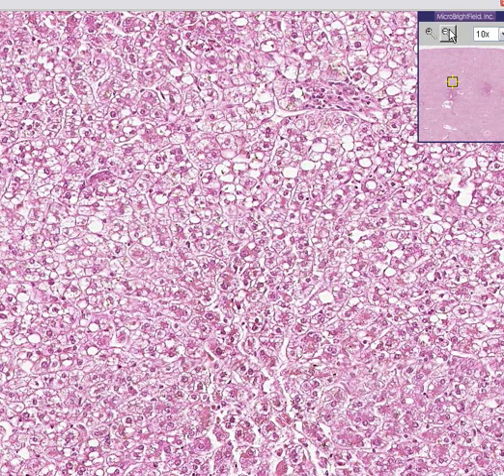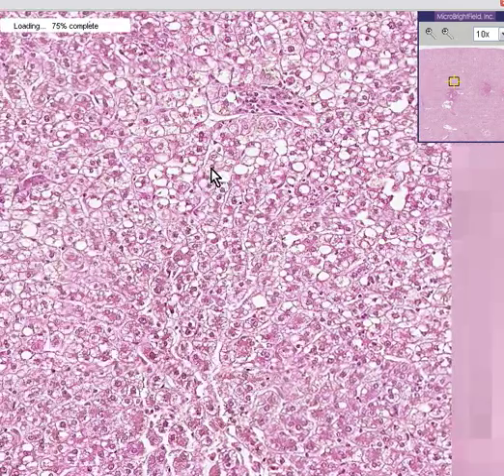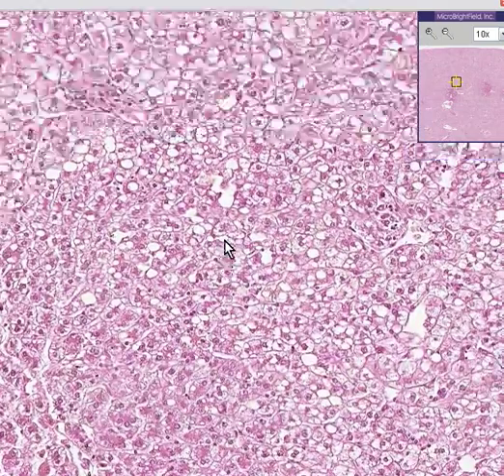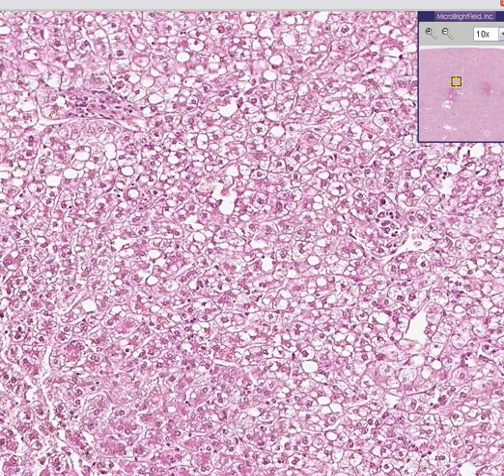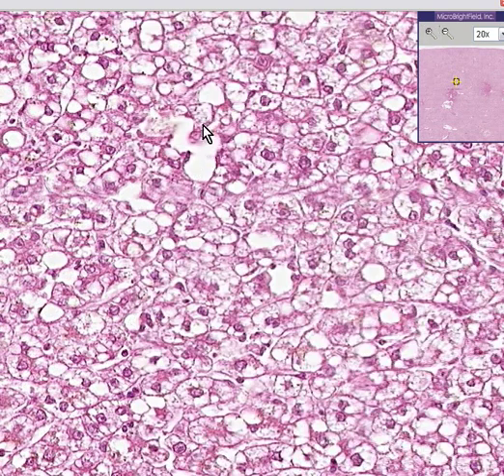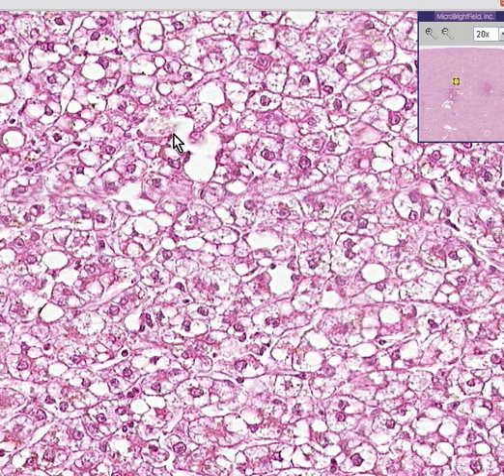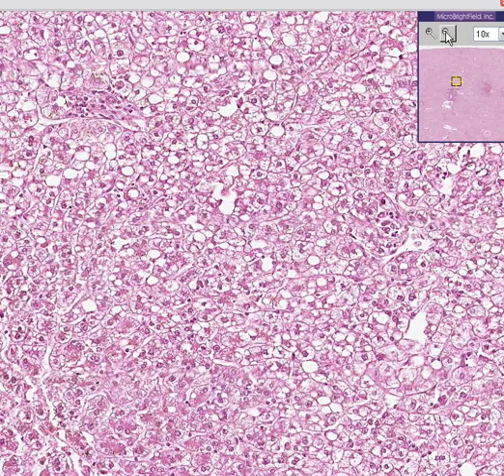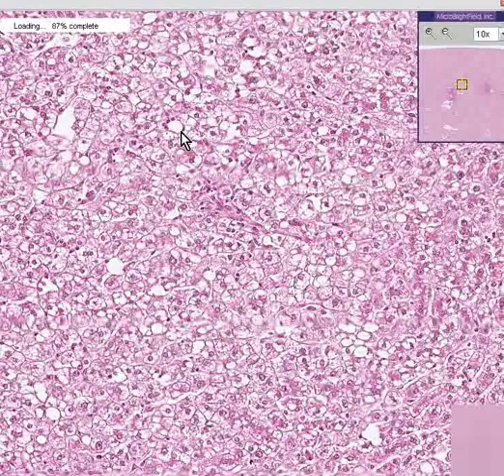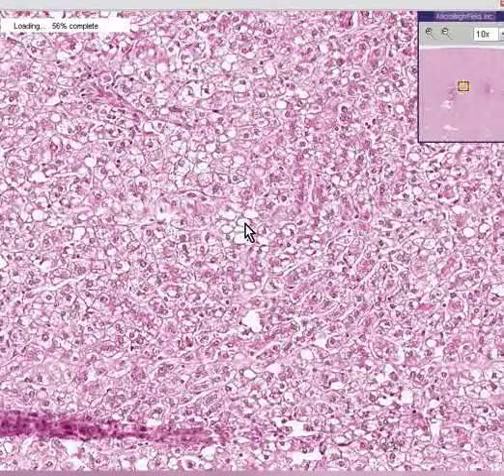In a macrovesicular fatty liver, the fat spaces are big enough to be actually larger than liver cells, and they may be quite huge. Although this is predominantly a microvesicular fatty liver, there are some big fatty globules out here which are much bigger than cells and they're not completely within cells. There's some more out here as well.